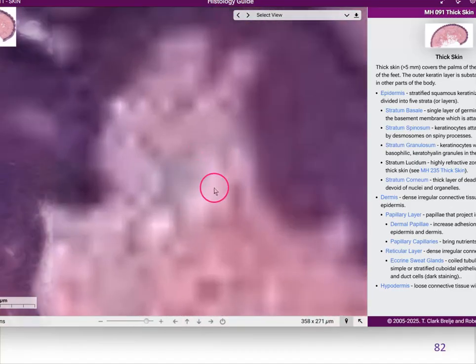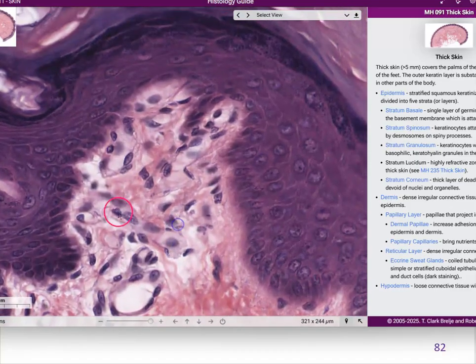Now let's look at that areolar tissue. This is a jumble. What I see is no pattern. I see cells that are not directly connected to each other, so this is not epithelial tissue. But I see fibers. I see what looks like probably collagen fibers, but not taking up much space. So there's a lot of space. You can see through this. And that's one way I know this is a loose connective tissue.